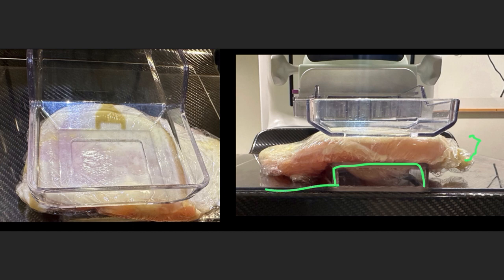It's compressed between the standoff pad here, and here's that plexiglass that attaches it on, and the normal biopsy compression paddle. And you can see what's happening is that breast tissue, I guess it is breast tissue, is bulging through here, making a thicker area of breast.